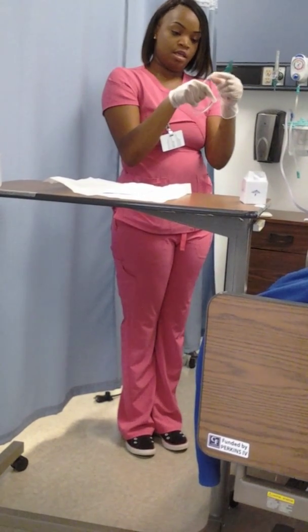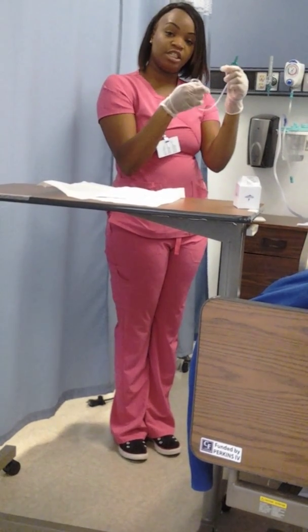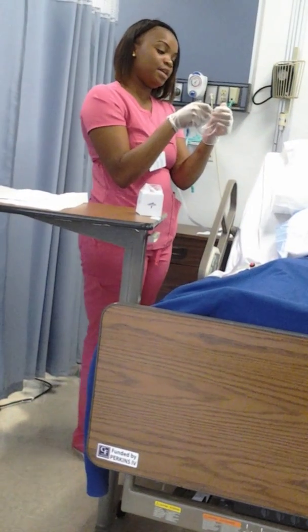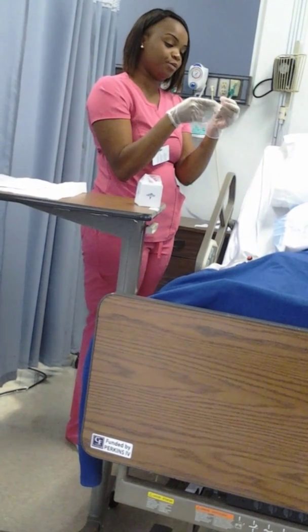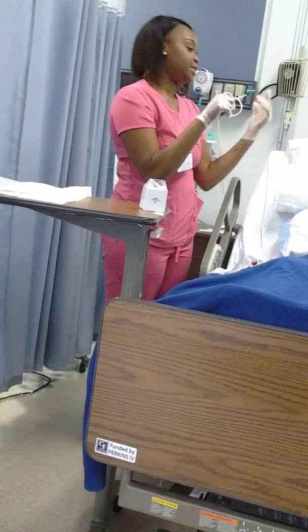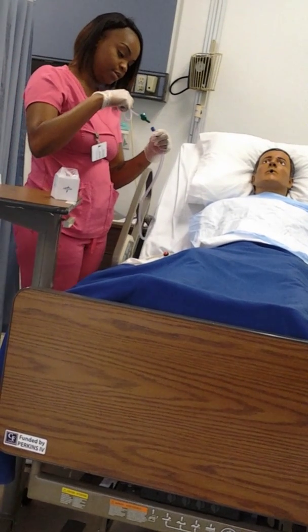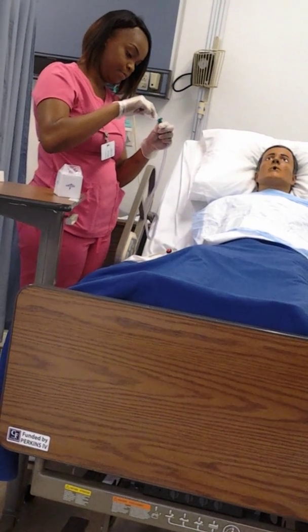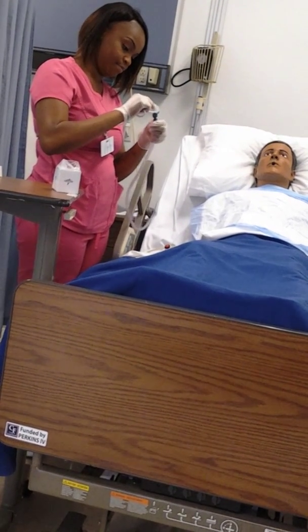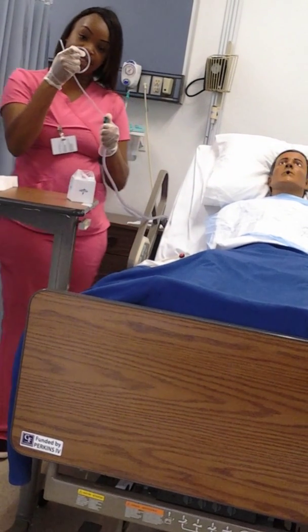Now, in the checkoff, it said to take away oxygen delivery if indicated. So with my non-sterile hand, once I get this full, this is still sterile. So with my non-sterile hand, I'll go ahead and take off the nasal cannula. I'm going to go ahead and connect my catheter to the equipment. Connected, it's still sterile. Now everything from the green part back is considered contaminated.